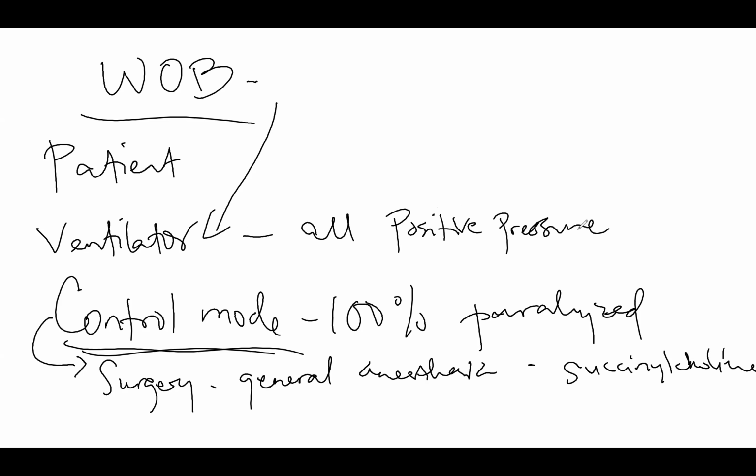When we first invented the ventilator, the very first were negative pressure. They mimicked the human body. So how we breathe is all done by our diaphragm. Unconsciously, the diaphragm contracts down. Air is sucked in passively into our lungs, and then the diaphragm relaxes or rises back toward the chest, and then that pushes the air out.